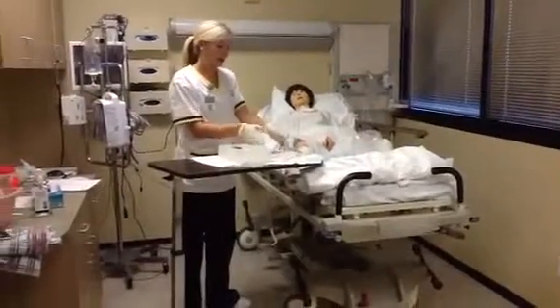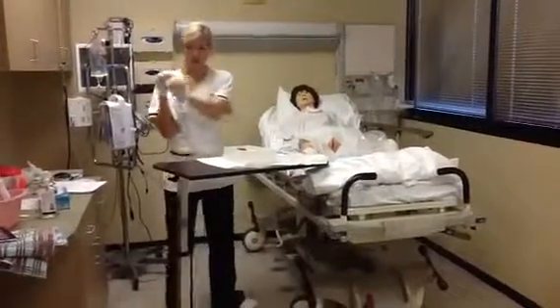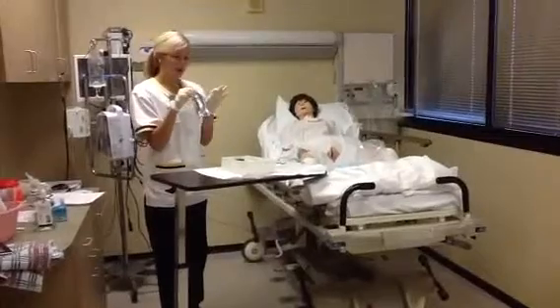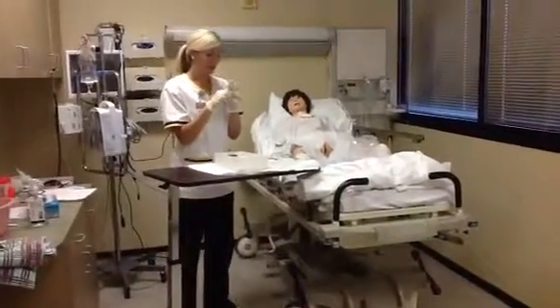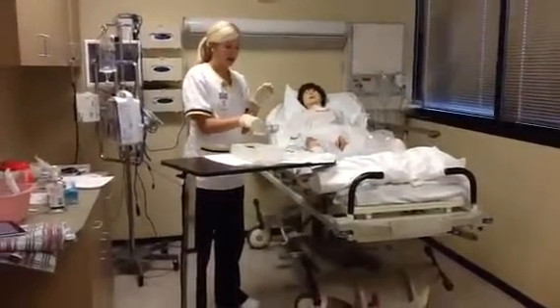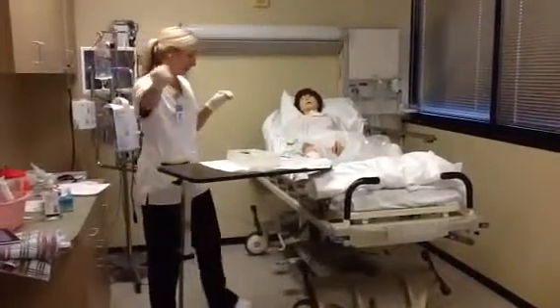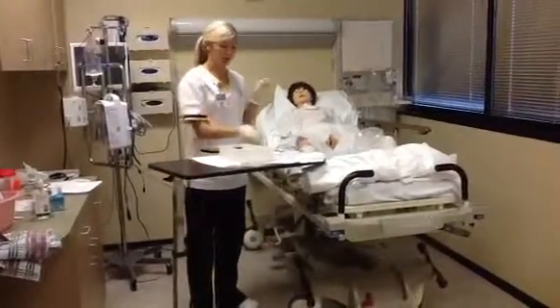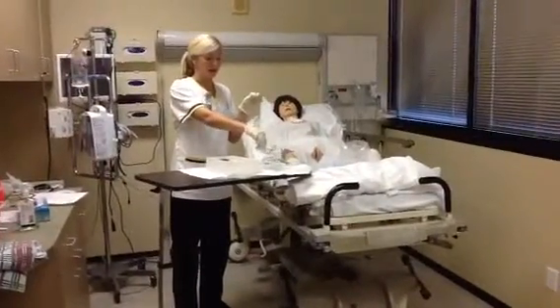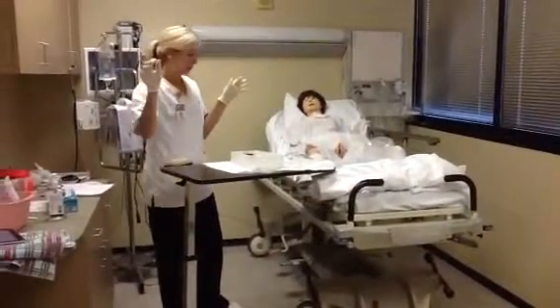So first I'm going to take my hydrogen peroxide, open it up, drop it. Again, I want to make sure I'm never putting my hands below my waist. So I'm going to take this hydrogen peroxide and pour it over my cotton swabs. Again, when I throw this away, not reaching over or turning my back. Next, I'm going to grab my lube, open this up, pour it in the box, come over here, not turning my back, throw it away.